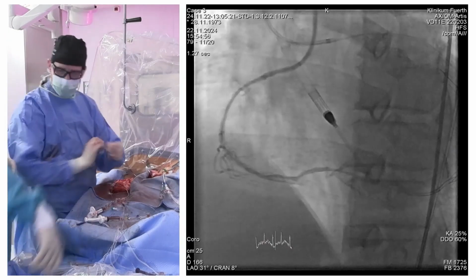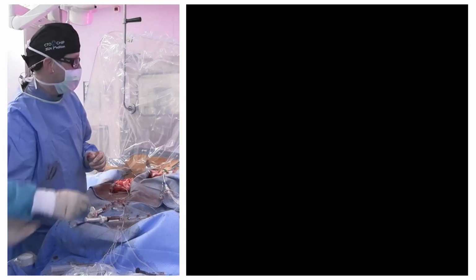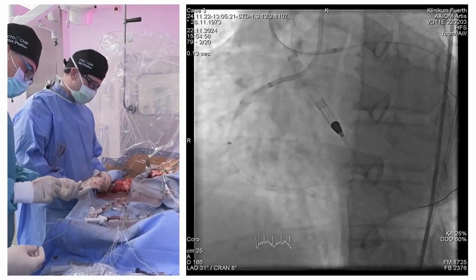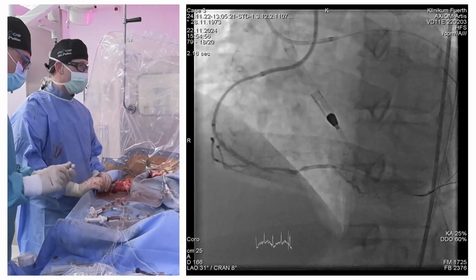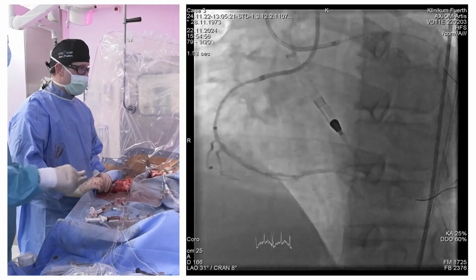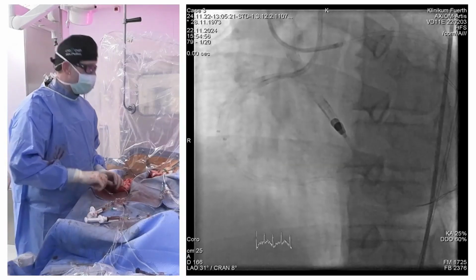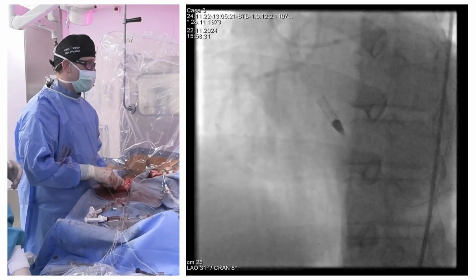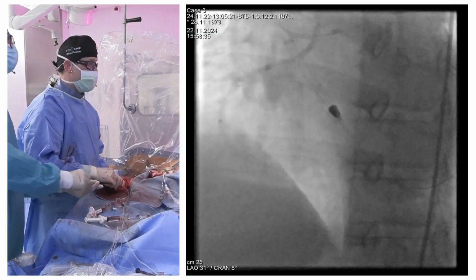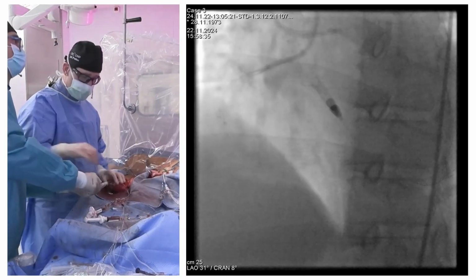So what will be your next step then? So, I'm still missing the PD branch. We dilated with 3.0 now the whole way to the distal stent. So I'm going to try to get this antegradely with the Turnpike. If that's not working, we still have the dual lumen catheter from the beginning. And if this is not working, I have all the gear for going retro.